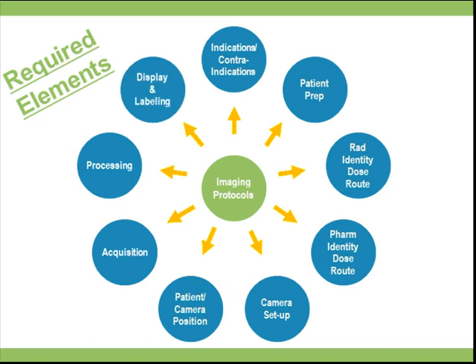And finally, camera computer-specific instructions regarding the images and data to be displayed for physician interpretation must be listed. This includes PACS instructions. Instructions for how the image will be labeled must be stated and include facility name, patient name, date of birth, patient identifier, date of the study, time interval, view or projection, laterality, and anatomic markers.